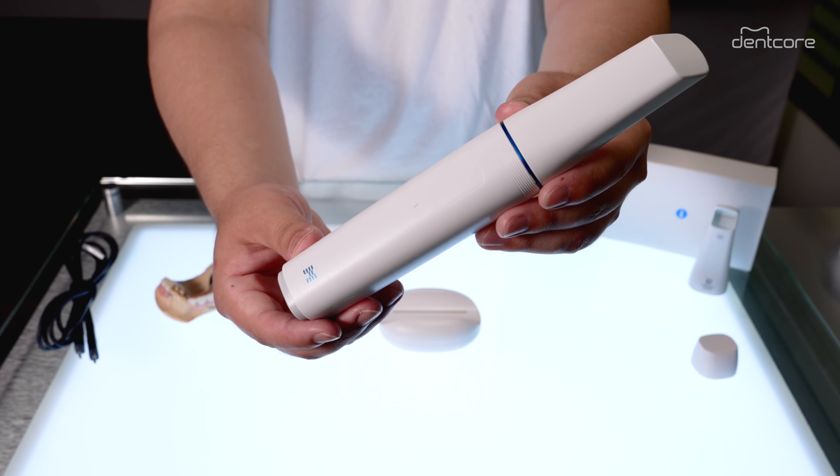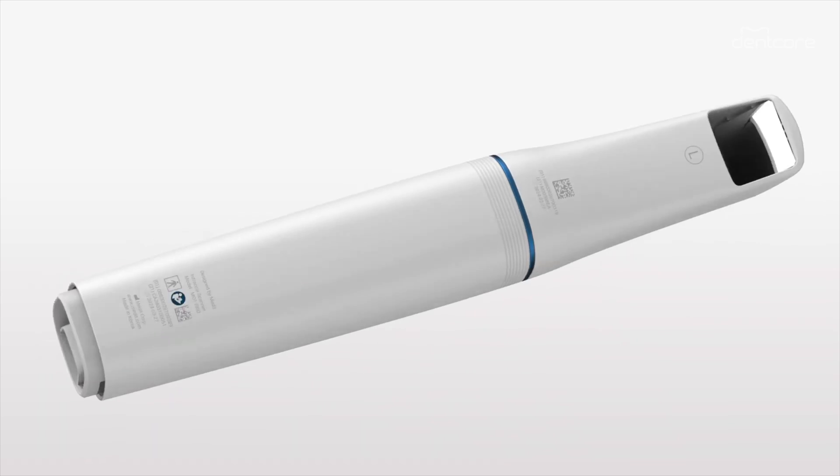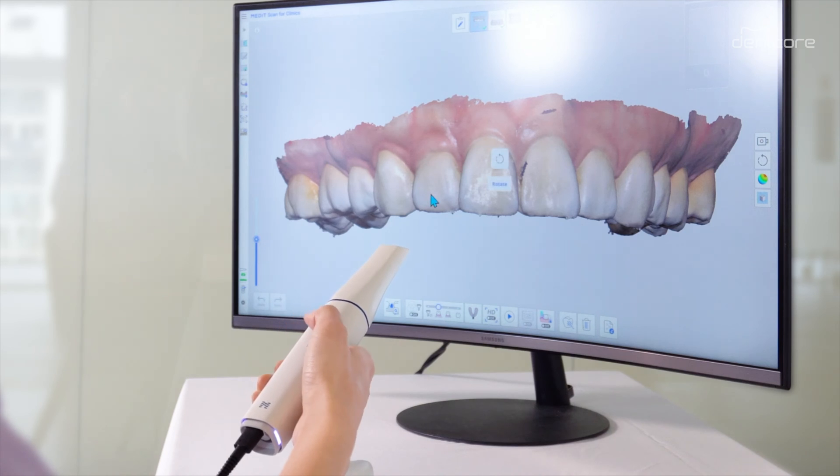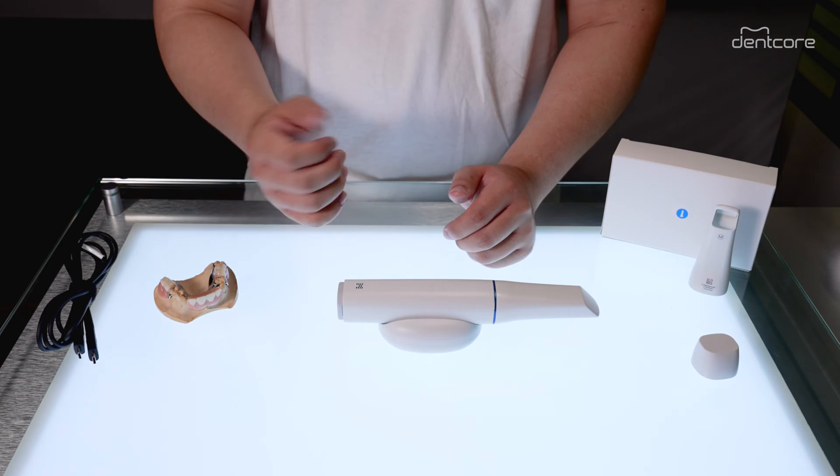With the Medit i900's touch pad, you can effortlessly rotate, zoom, and pan through your scan data — the control literally at your fingertips.